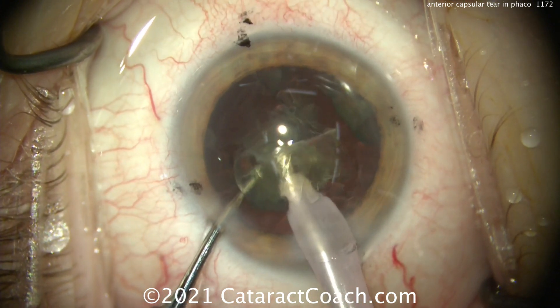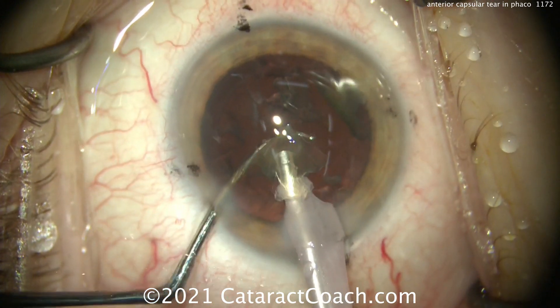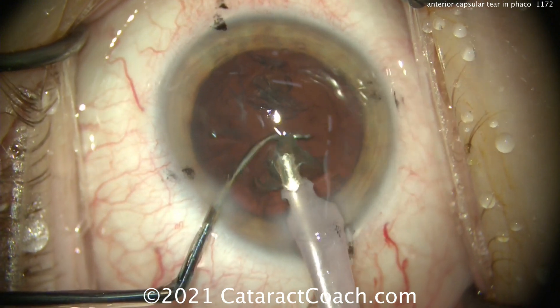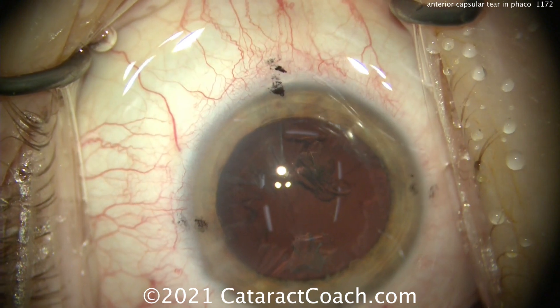Think about it — 14 microns is two red blood cells, so a very thin tissue. And as we remove the cataract piece here, we're still not aware of it just yet. But when that last cataract piece comes out, we can look and notice that there's a tear in that anterior capsule.